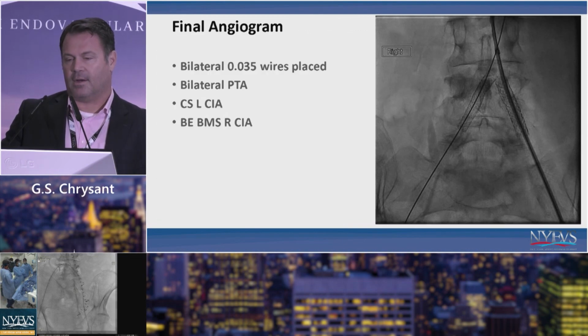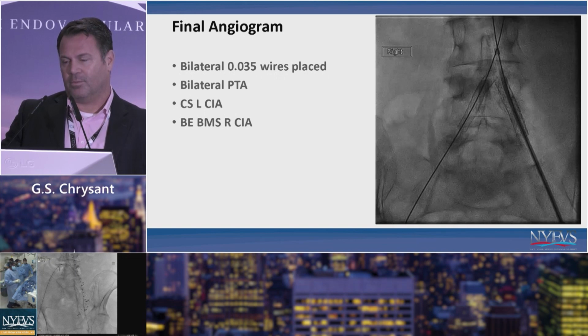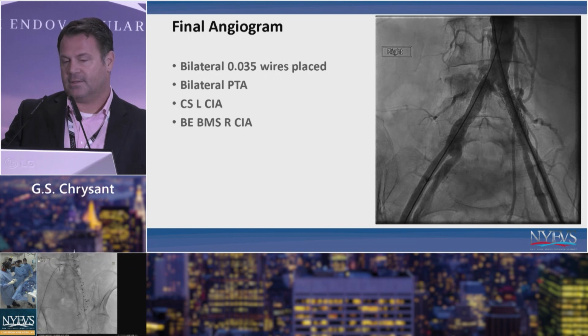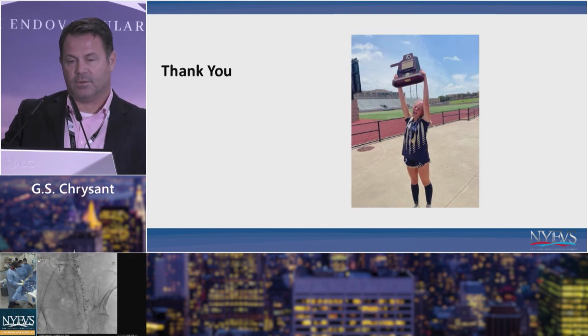Luckily, I got away with ballooning it open and then put 2, again, bare metal balloon expandable stents, and went up both sides with IVUS and ended up with a decent result.